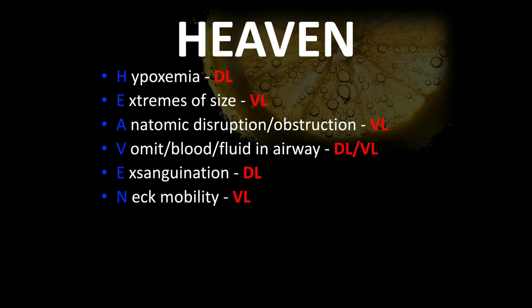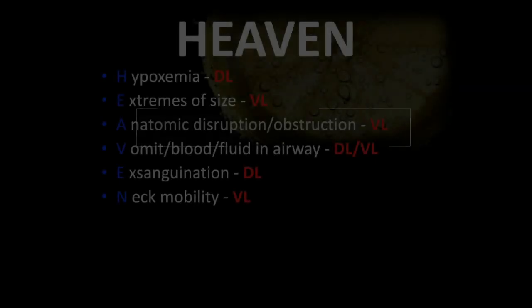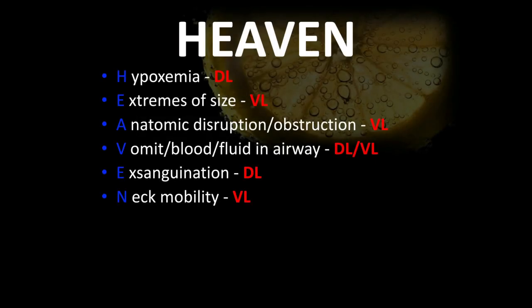Because remember, we want a first pass success, but we want first pass success without desaturation. I can't state that enough. Without desaturation, it's all right to stop and regroup. And that's where you work with a partner that's watching the monitor. Again, it comes back to your awareness of SpO2 and hemodynamic stability. Can you trust the SpO2? Is the equipment you're using giving you a true reflection? Are you using that Masimo ear sensor that gives you a pretty instantaneous change versus maybe a standard finger probe?